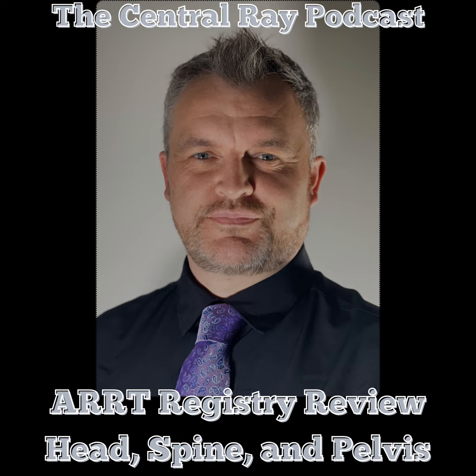For the cross-table lateral, the femoral neck should be visualized without superimposition. In Judet views, ensure proper rotation by evaluating the open and closed appearance of the acetabular columns. Misalignment, inadequate rotation, or improper central ray angulation can result in foreshortening or distortion, so always assess your image critically.